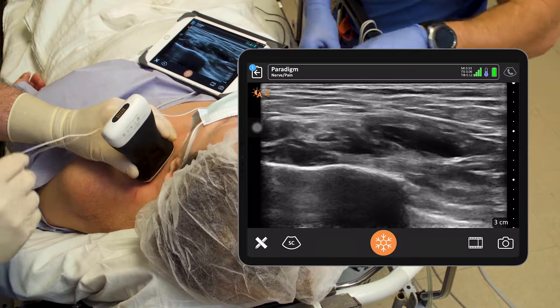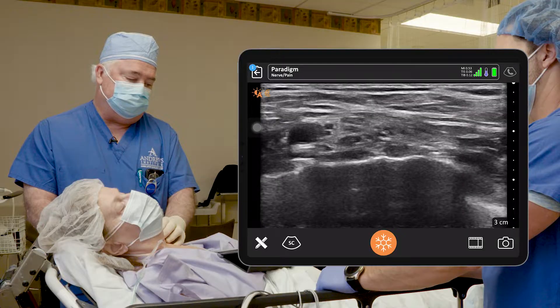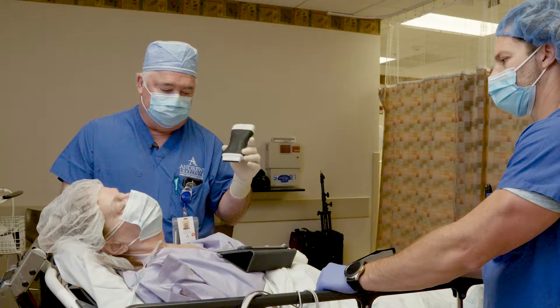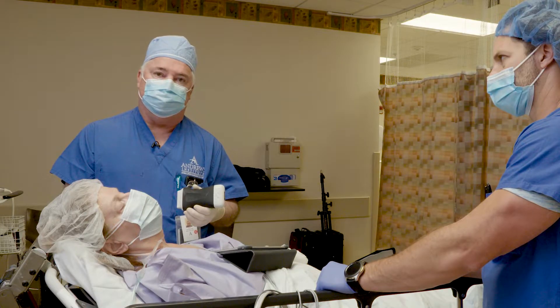Beautiful. And that concludes our supraclavicular block. Again, a great case for a regional anesthetic, and a great case for a wireless ultrasound probe — the Clarius. Really nice images that we can use. So that'll finish up this supraclavicular block. Thank you.